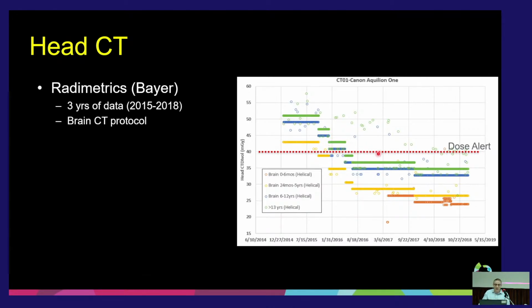And we did that and we did that until we got to a point where they said, we're okay with this dose. We can see what we need to see, but we feel a little bit uncomfortable with the fact that if we keep going, we're going to start missing things. So this is a very non-scientific way to approach it. There are completely different ways to calculate this, and we're going to talk about them tomorrow and on Friday. But this was a very simple way, in a stepwise, methodical way. We just lowered our doses just a little bit at a time.